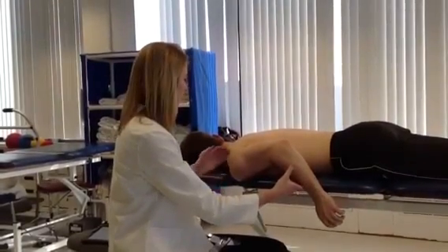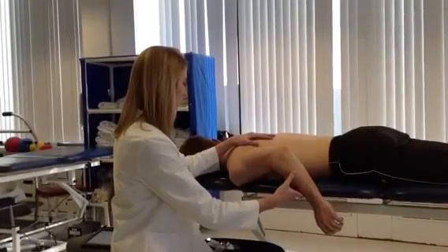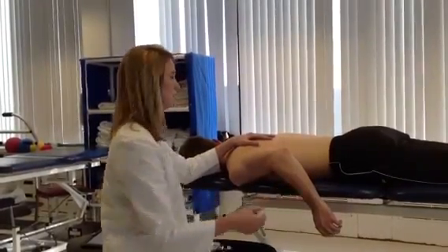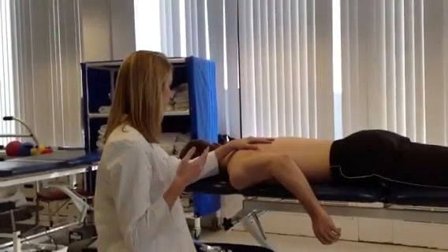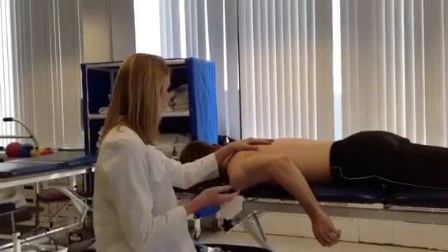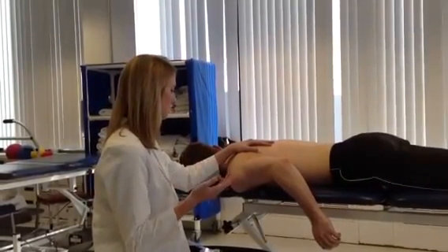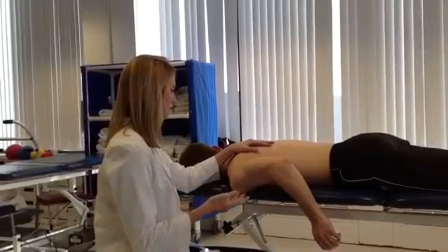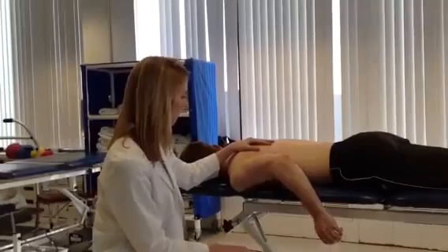So go ahead, and I'm going to stabilize on your back, and since this is shoulder complex motion, you can be using the complex of your shoulder blade and your collarbone and your shoulder joint to extend your arm upward toward the ceiling as far as you can go. So go ahead and show me how far you can get that to go.